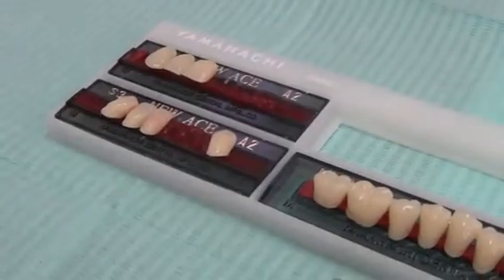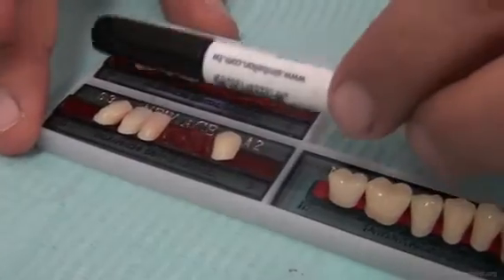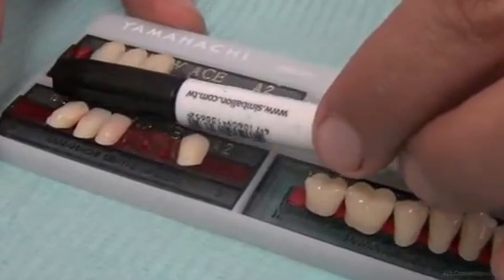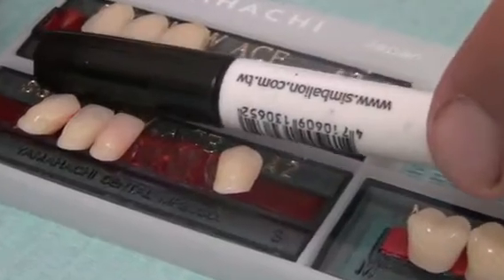Now, after finalizing the position, we're going to add in the canine. One of the rules for setting lower anterior teeth is that we should have the incisal edges all straight, central, lateral, and distal of the canine straight in one piece.